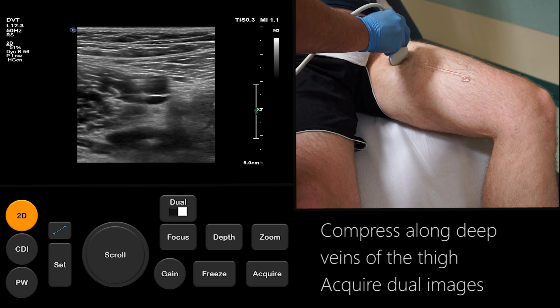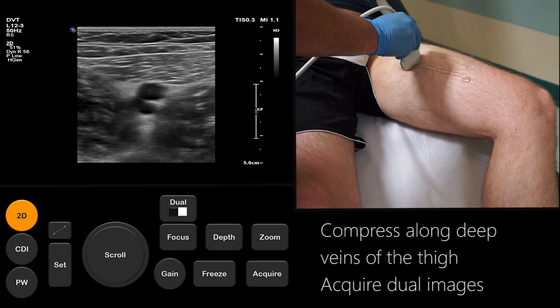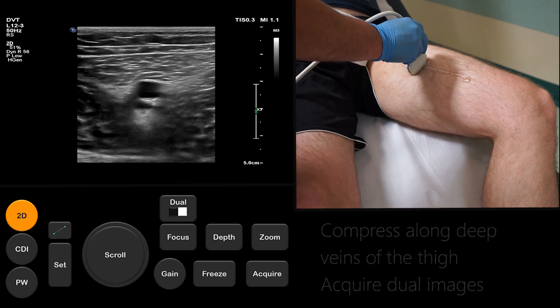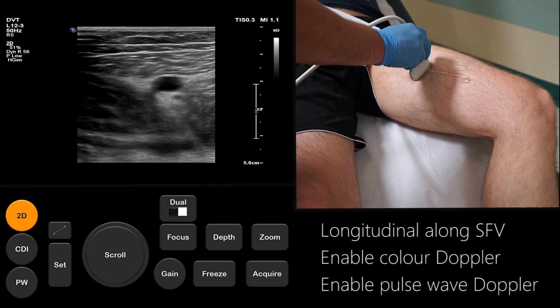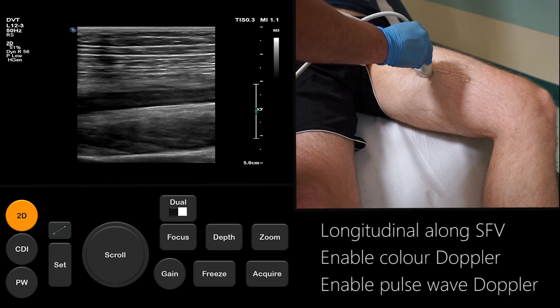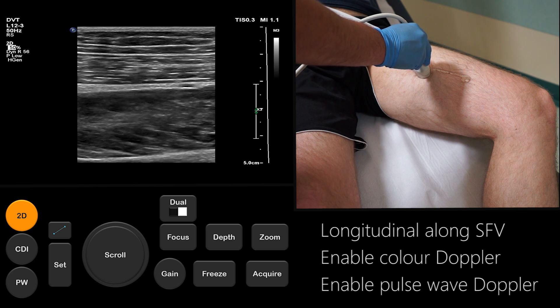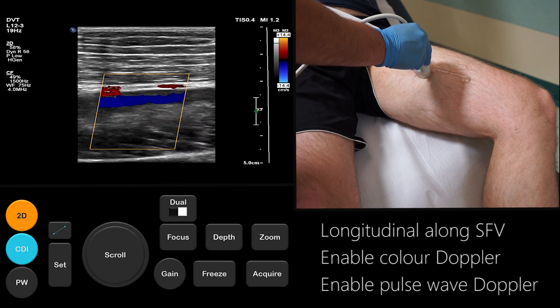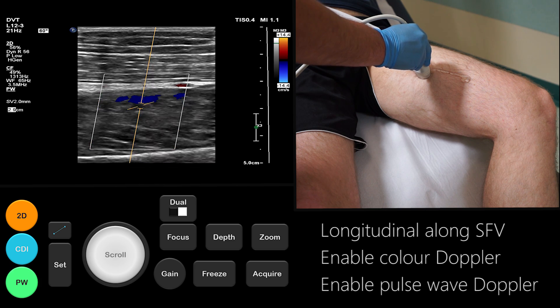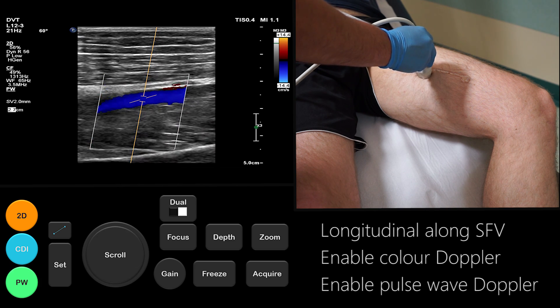Then continue compression along the SFV until the mid-thigh. At this point, turn the probe 90 degrees into longitudinal section and enable colour Doppler. With colour Doppler showing flow in the mid-SFV, use pulse wave Doppler and center the cursor onto the vein.